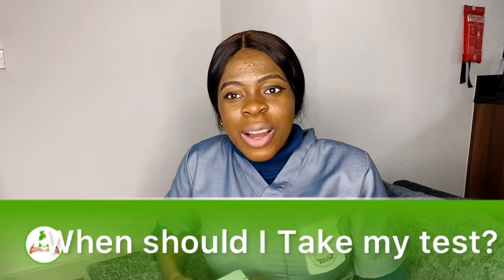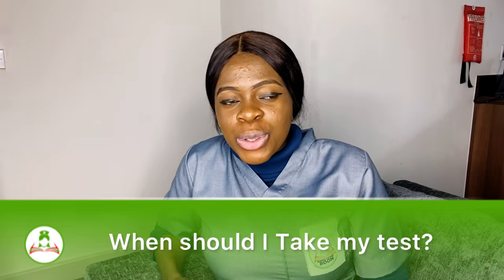The most accurate that I will tell you is that immediately you miss your period, you're supposed to see your period on the 16th, 17th, 18th, you've not seen it, do the pregnancy test. A day after you missed your period, you've not seen it, do a pregnancy test. You can get an accurate result at that moment.